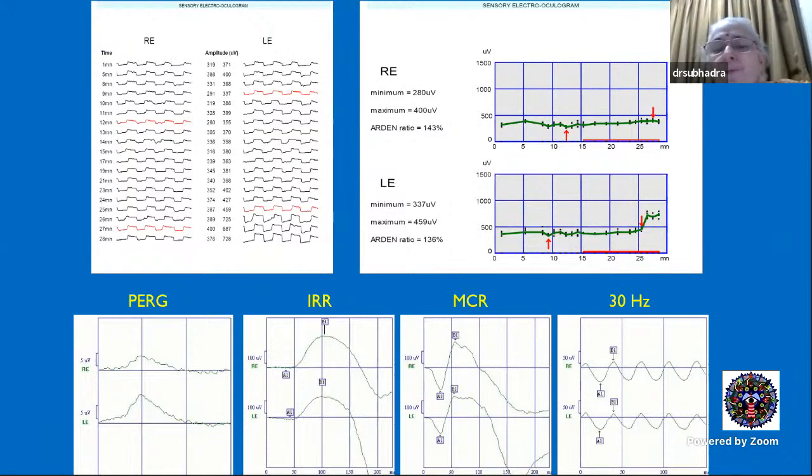They will get confused with the other findings in BEST disease because the lesions will stain. If you do FFA in a normal BEST, you will think there's a leak because this lipofuscin will take up staining and you will mistake it for CNVM. So we have published on OCT angio in BEST. Look up that article. Okay, next.